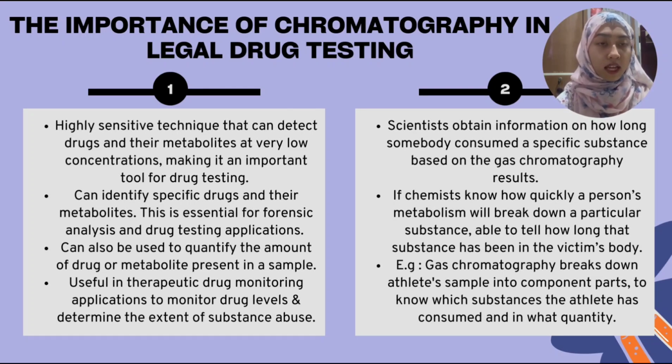Chromatography is a highly sensitive technique that can detect drugs and their metabolites at very low concentrations, making it an important tool for drug testing. Additionally, chromatography can identify specific drugs and their metabolites, which is essential for forensic analysis and drug testing applications. Chromatography can be used to quantify the amount of drug or metabolite present in a sample. This is useful in therapeutic drug monitoring applications to monitor drug levels and determine the extent of substance abuse.